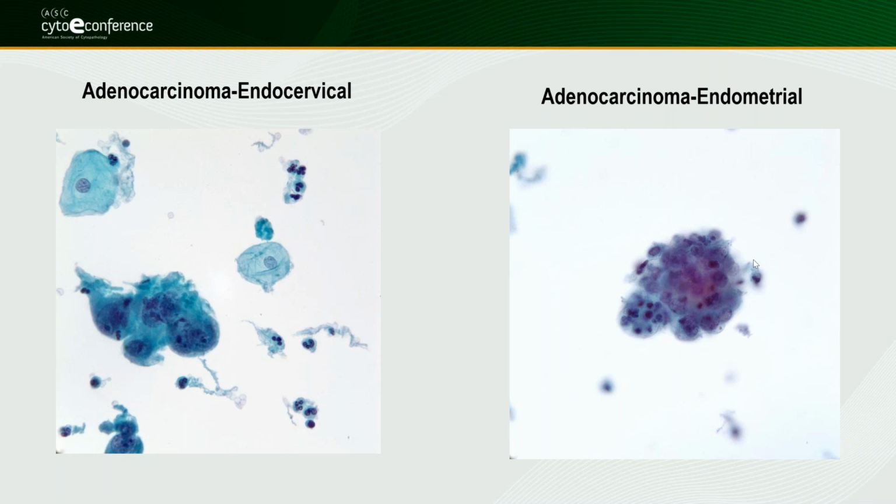And on the right hand is endometrial adenocarcinoma. You have this vacuolated cytoplasm with a lot of neutrophils in the cytoplasm, and the cells are just a bit smaller. And again, when it's typical, it's easier, and when you're not sure, try to use ancillary studies if you have them, or you may know the HPV status.